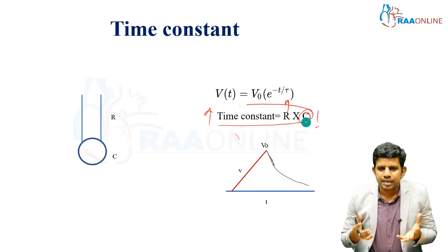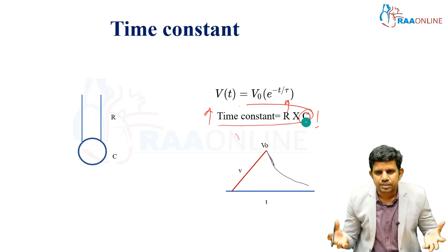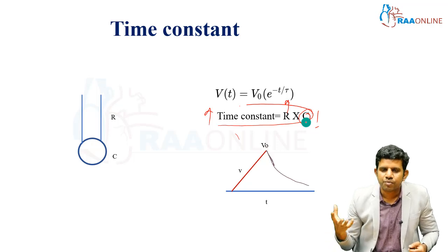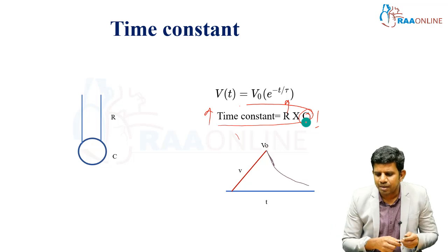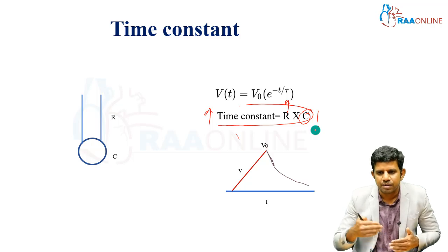So which clinical conditions increase resistance? The most common causes of increased resistance and increased time constant are COPD, bronchospasm or excessive secretion. In all those conditions, resistance will increase and time constant will increase. Rarely will compliance increase, especially in emphysema. There are no other common reasons for increased lung compliance. Compliance commonly decreases, resistance commonly increases.